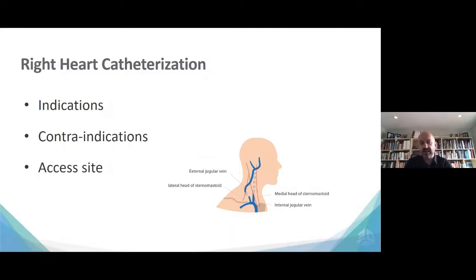But then the use of Swan actually decreased quite considerably, because a lot of studies came out showing that Swan-Ganz catheters probably don't extend life, and there were some complications with them. However, as I said, we've come back around full circle, and we've really learned how to use them nowadays, and how to have limited indications. And in these difficult patients, it's actually quite helpful to have them.